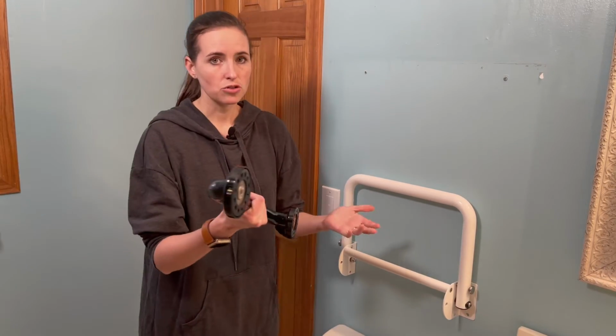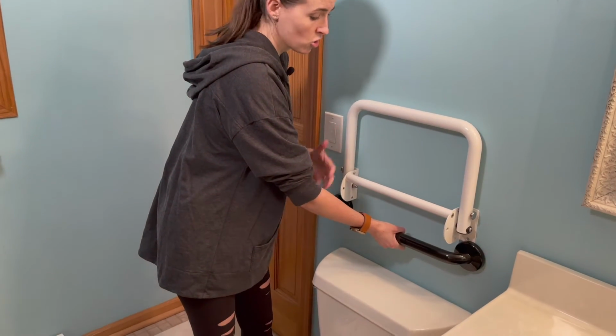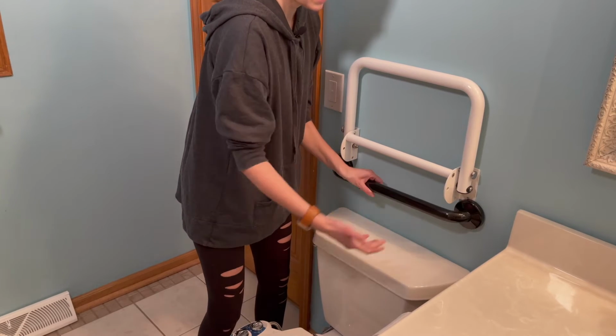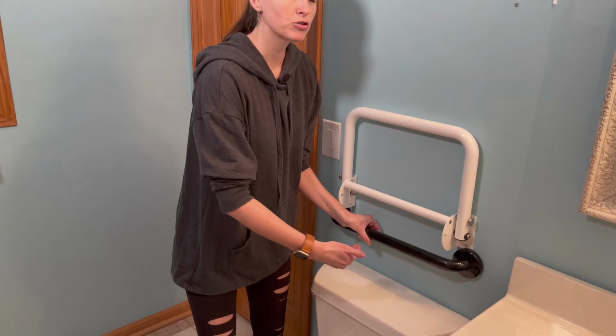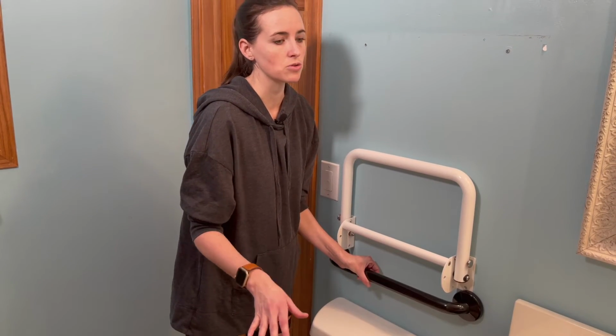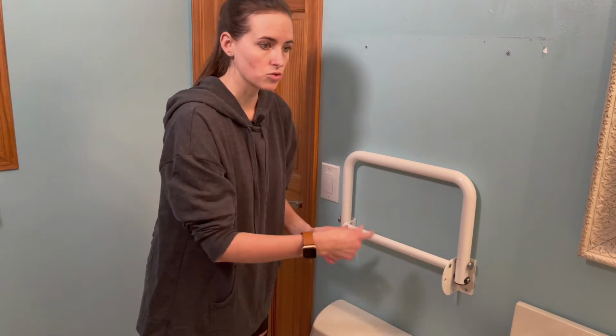Now, many people have probably seen the standard grab bar mounted behind a toilet in this type of position, which is great and can be used, but it has some limitations. It's quite far away from the user if you're at the front of the toilet. So unless you're approaching from the side, the posterior or back of the toilet grab bar can be a little tricky to use. So that brings us to the Ponte Giulio drop-down grab bar.